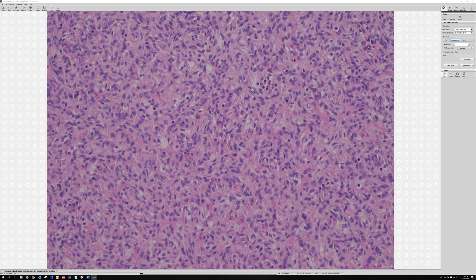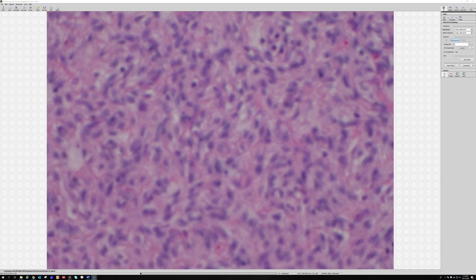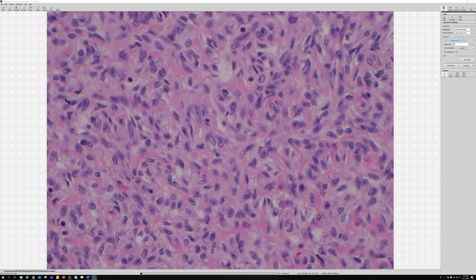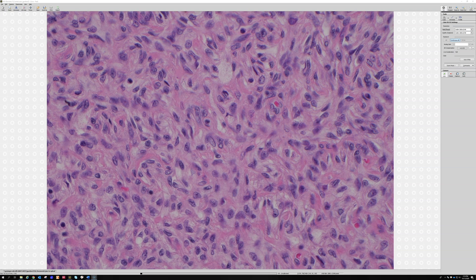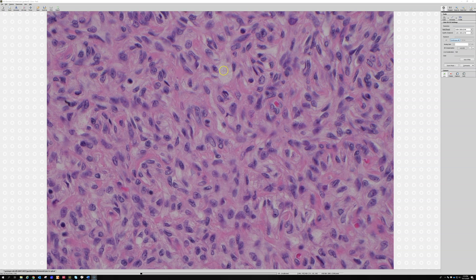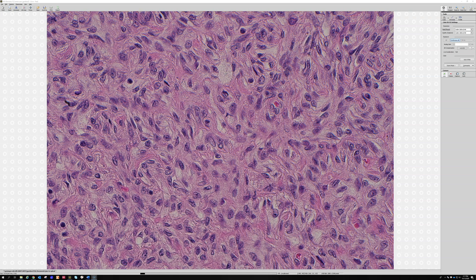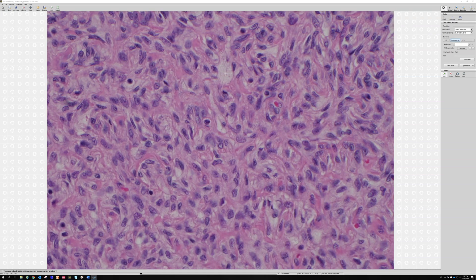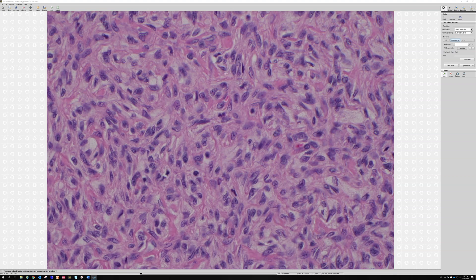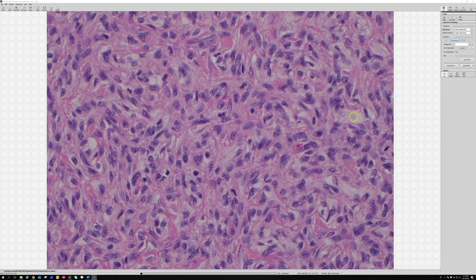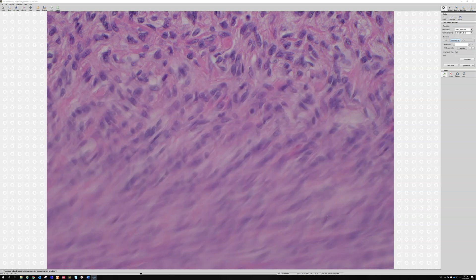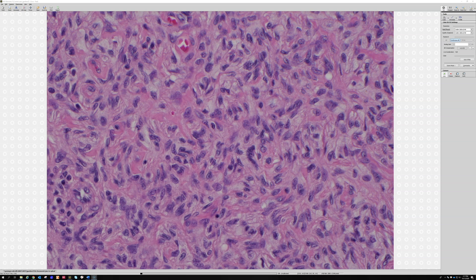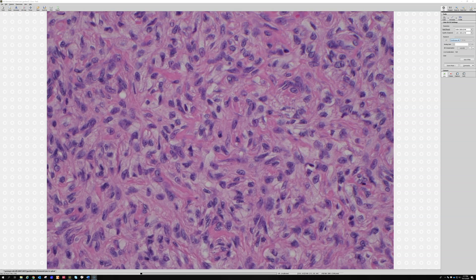One thing that stands out to me here is these kind of cells are plump, look like fibroblasts or histiocytes or something. There's some foamy cells here. Sometimes when we flip the condenser it'll help us see the foamy bubbliness, particularly under the microscope, but there's actually a lot of foamy cells in here, like xanthomatous frothy bubbly cells.